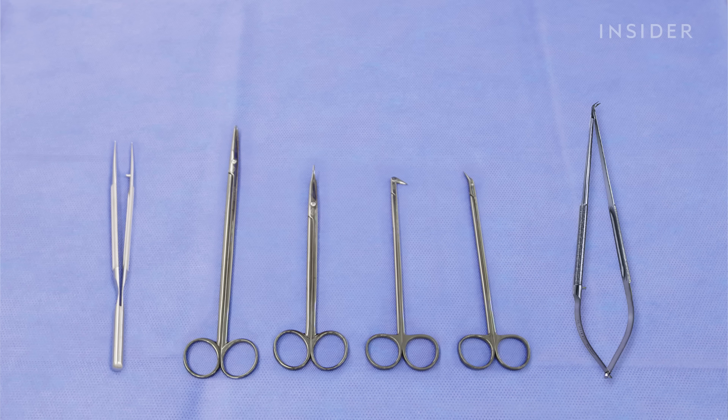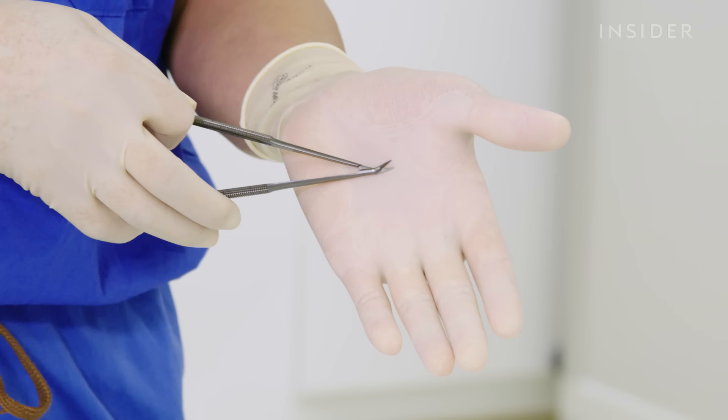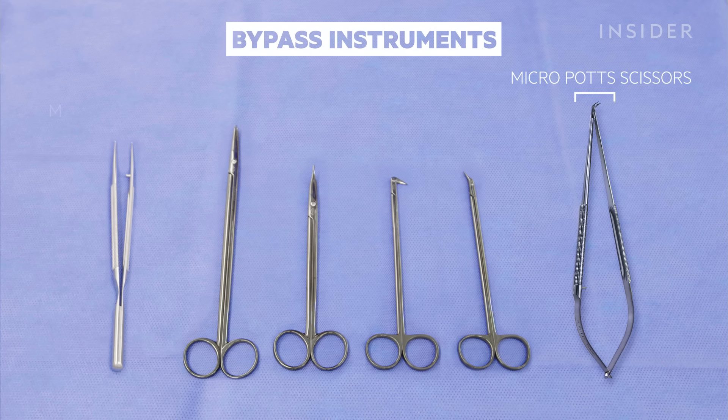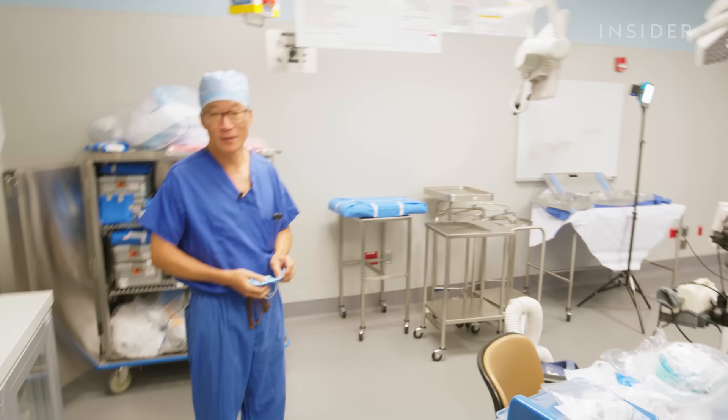These are the instruments that we use for the coronary bypass part of the operation where we're sewing on the arteries on the surface of the heart. You can see that they're all normal-sized instruments but the tips are very, very fine. These are called micro Potts scissors, and these are the scissors we use to open up the actual coronary artery. These are called mammary pickups — the forceps that we use to handle the coronary arteries — and you can see how fine the tips are.